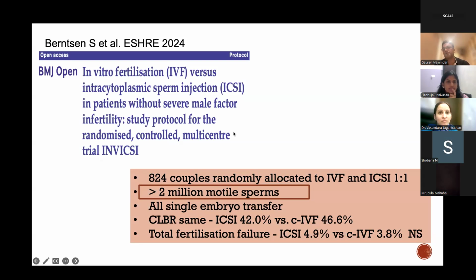then the concentration becomes 200,000 sperm, and 200,000 sperm is going to fertilize 6 eggs. There are 6 OCCs in that space. So per egg, you can assume about 30 to 40,000. You divide 200,000 by 6, which is about 35,000 sperm per egg.